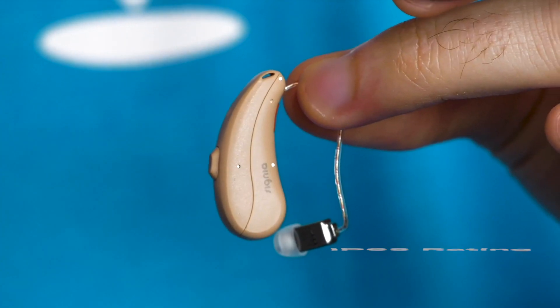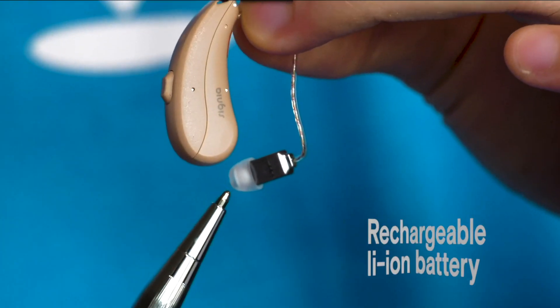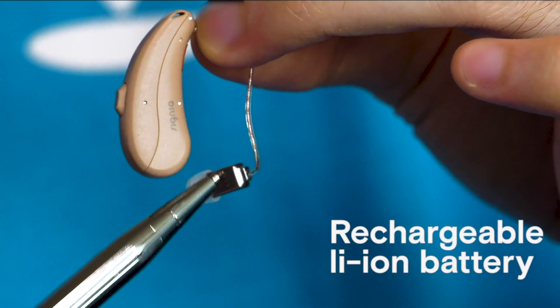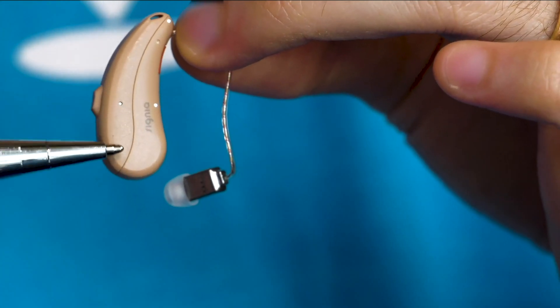Here's an example hearing aid. It has an IP68 rating and a built-in rechargeable battery. See how there are no lines in the casing for a battery door? There's only one joint along the entire unit — that's what you want. According to the IP rating, this hearing aid should be able to withstand immersion in water, but let's test it out.